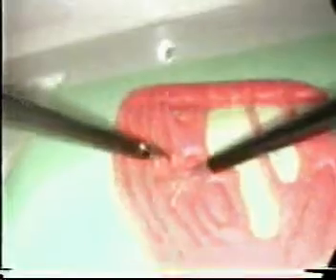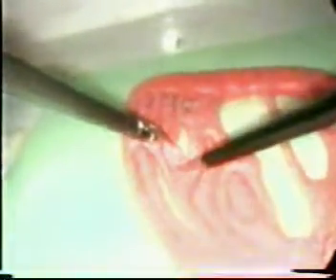Use the scissors as appropriate, always ensuring that before you actually cut, you can see that the scissor tips are correctly placed.